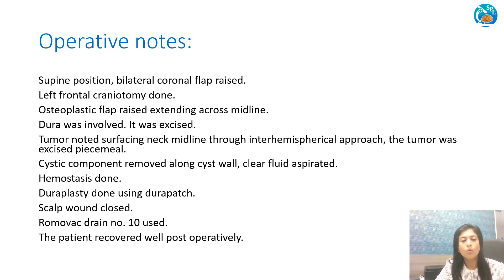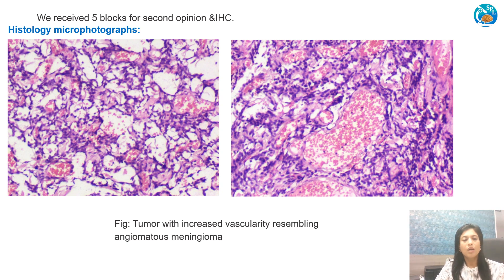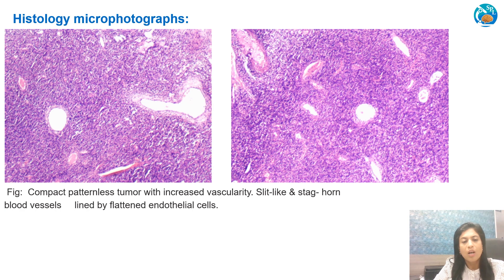These are the operative notes. Left frontal craniotomy was done. The tumour was solid-cystic and was completely excised along with the cyst wall; the patient recovered well post-operatively. We received five blocks for second opinion and immunohistochemistry. The histology slide revealed a tumour with increased vascularity resembling angiomatous meningioma. The tumour was compact, patternless, with increased vascularity; the blood vessels were slit-like with staghorn appearance and were lined by flattened endothelial cells.